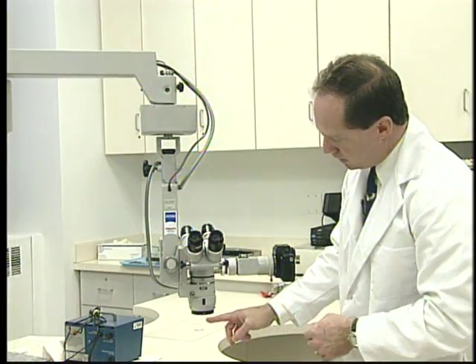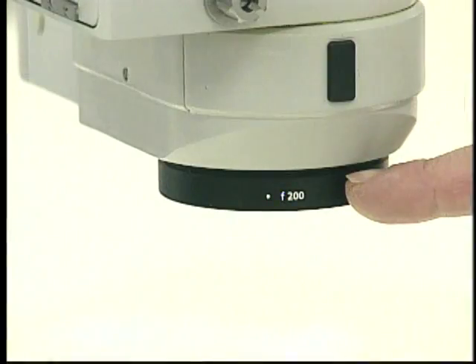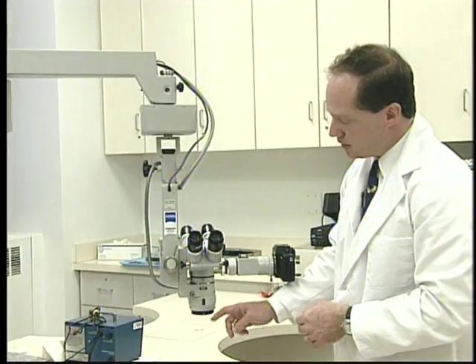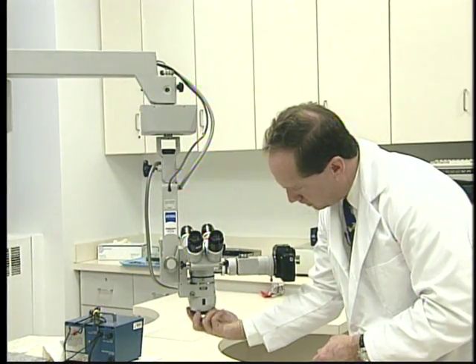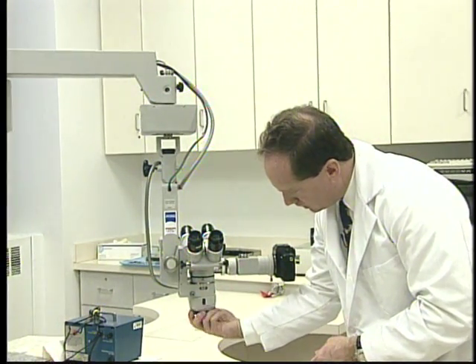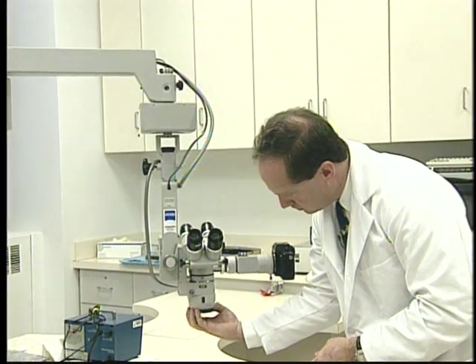If we go down here, we see this one happens to say f200. Now what that means is that the focal length of this lens is 200 millimeters. Let's see if we can unscrew the lens here.